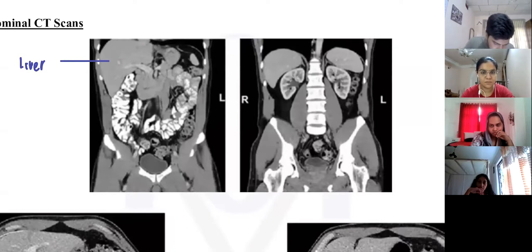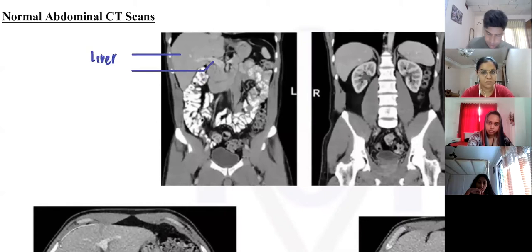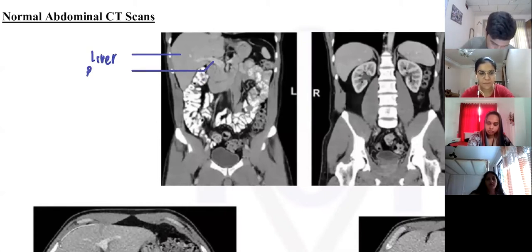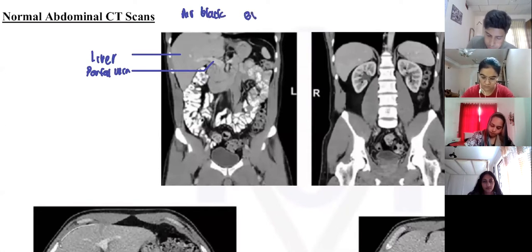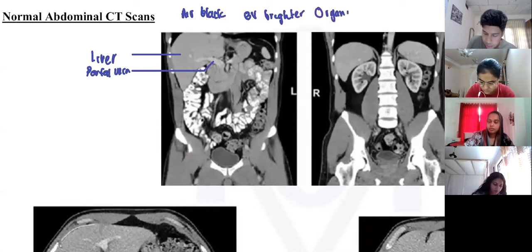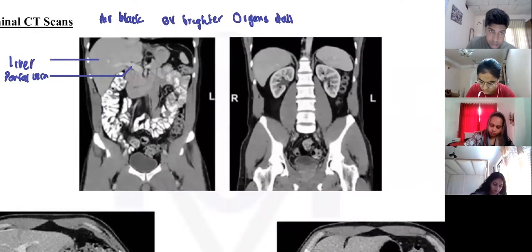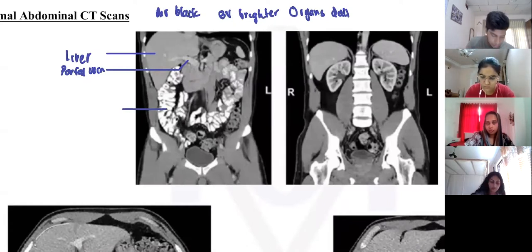There's a structure here which I explained. Can you tell me what this is? It's a bit brighter than the other structures. Remember this: air is black, blood vessels usually appear more bright, and solid organs they are dull. If there is a contrast, you can see here the large intestine with barium contrast appears really bright. Remember those facts.